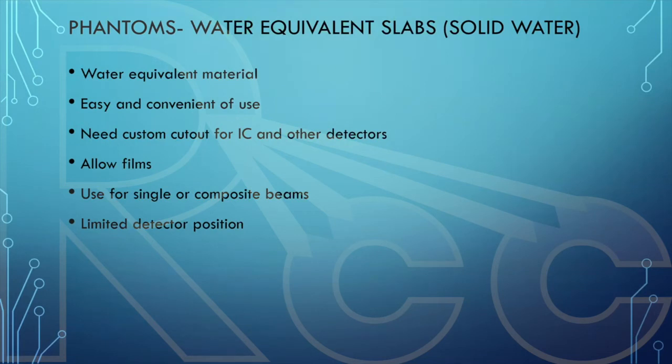It allows you to use it with films. You can use it for single or composite beam measurements. However, it is limited in detector position. So how you customize your cutout for your ion chamber, that's what this limited detector position is referring to.